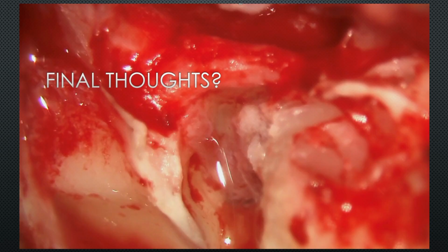Yeah, I think I'd probably try to start endoscopically, but I think you could probably do it either way with as much success. I think an endoscope's nice to look around those corners for sure. Sometimes, of course, you get around the corner and then getting to the disease is always difficult, and you probably have to drill away some of that bone anyway, but I think either way would work well.